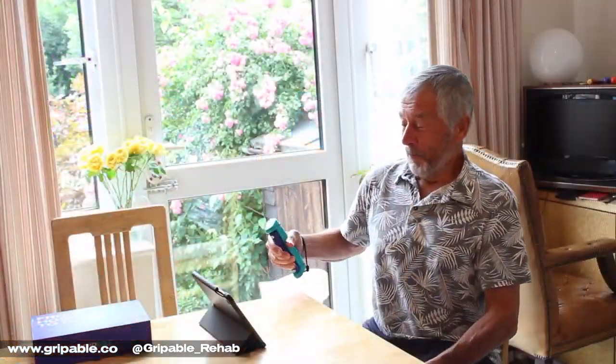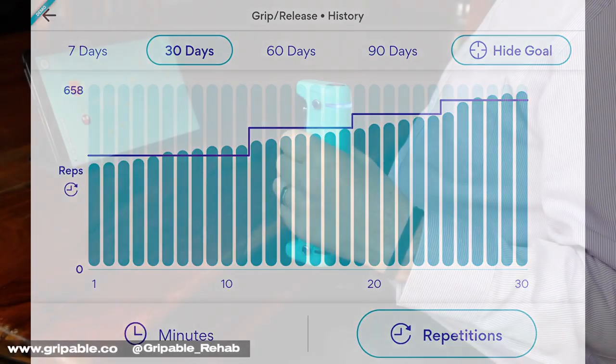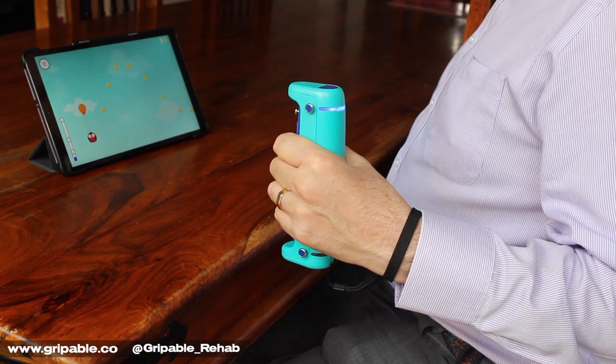The app has engaging activities and allows the therapist to set daily goals and track daily use. Activities can be chosen based on therapeutic goals.